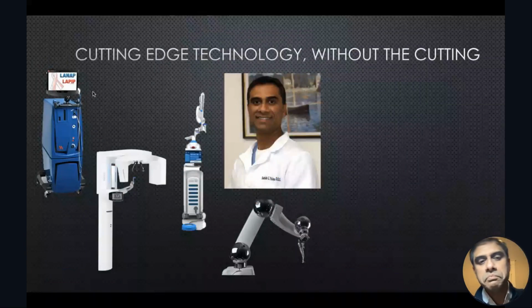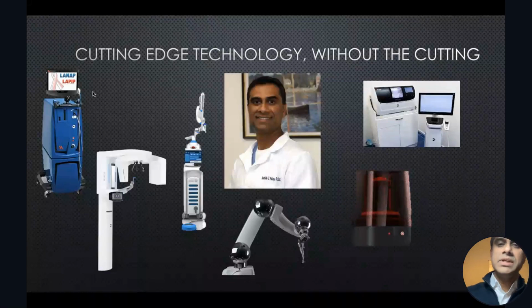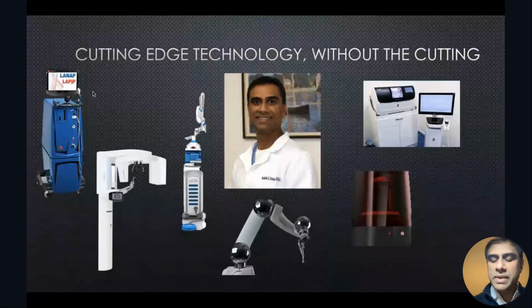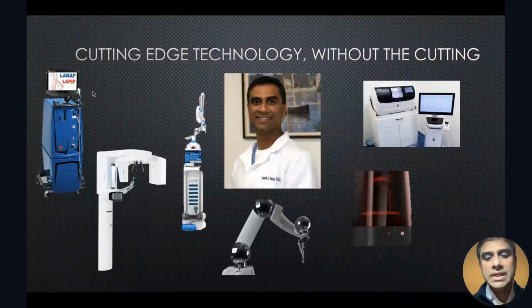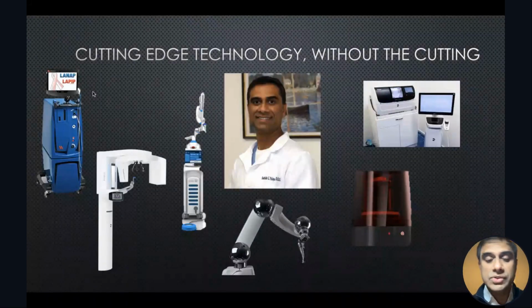And that's when I was able to incorporate a CBCT. So today's protocol in my office for a patient when they come in is that as soon as they come in, we take photographs. We go in and talk about taking a CBCT. Once we have discussed the treatment plan, we actually go right into surgery. There's really no waiting time, and it's especially useful when patients come in with anterior teeth issues.